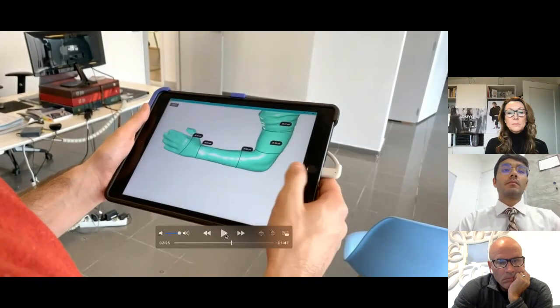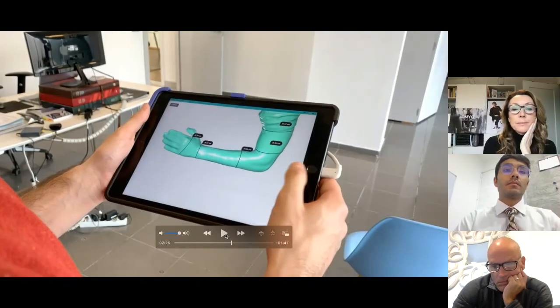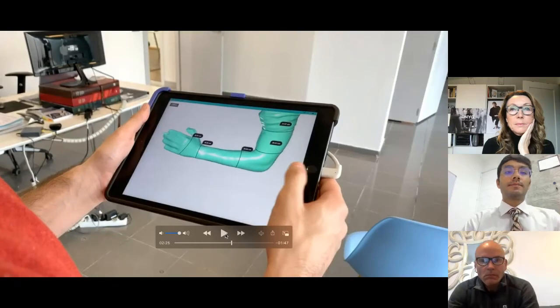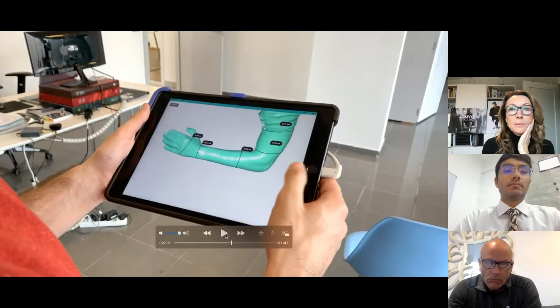Okay, so when the identifier stops, right now we have all the information of the anatomy, okay? And also we show some slicing cuts. This is important for us because the professionals can check that the virtual dimensions versus real dimensions are correct. And at the same time, this is a part that has to be there to get the medical device certification, with all the ISOs, CE and FDA approvals. And well, we have to have this screen to show at this point.